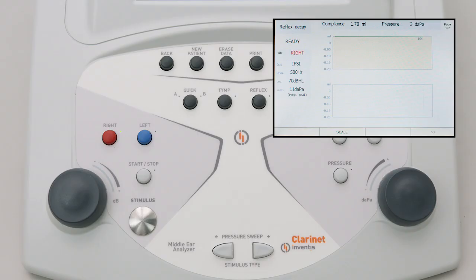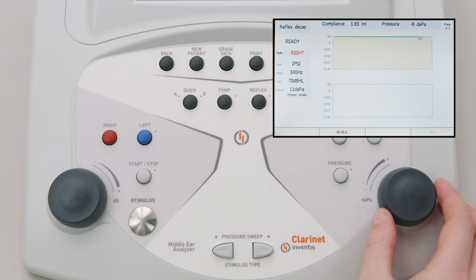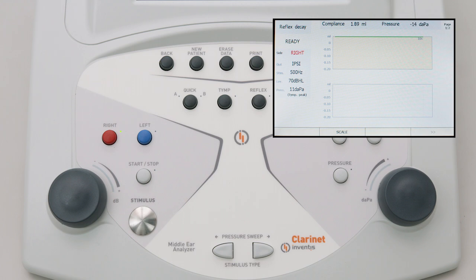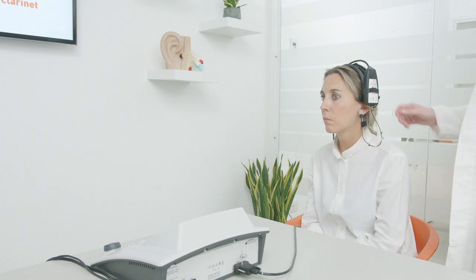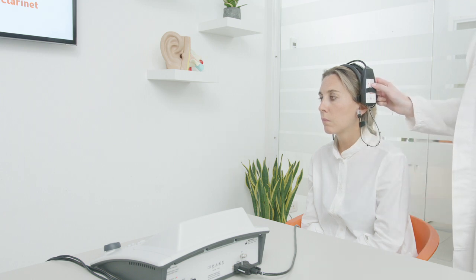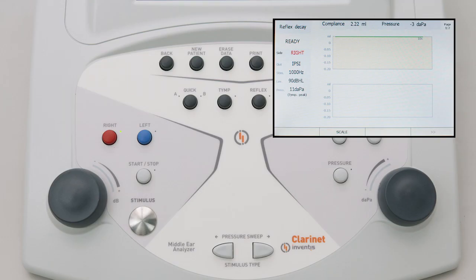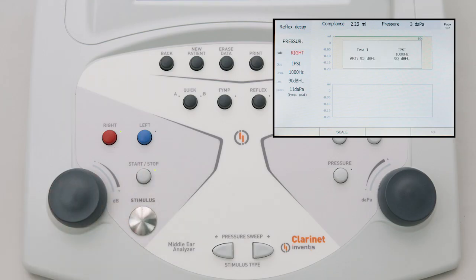Four different graphs are available for each ear. Graphs are shown on the screen two by two and the operator can navigate from one to the other using the right hand control knob. Before starting the exam, enter the settings window and set the stimulus activation time to be 10 or 20 seconds. Then introduce the probe into the patient's ear and start the exam by simply pressing the start button on the keyboard or on the control box.